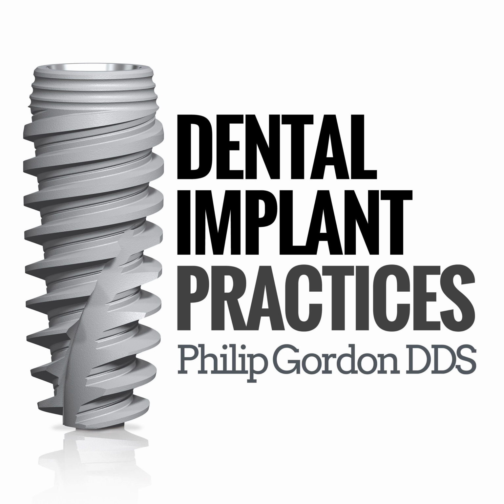With that, there are cover screws. What I like about Implant Direct is they provide a cover screw and a healing abutment. So, depending on the degree of torque, the surgical considerations, the type of gingiva, the type of bone, whether or not you're adding bone grafting, you can cover it up with a cover screw, like a two-stage approach, or you can go straight to a healing abutment, like a one-stage approach, or a temporary.